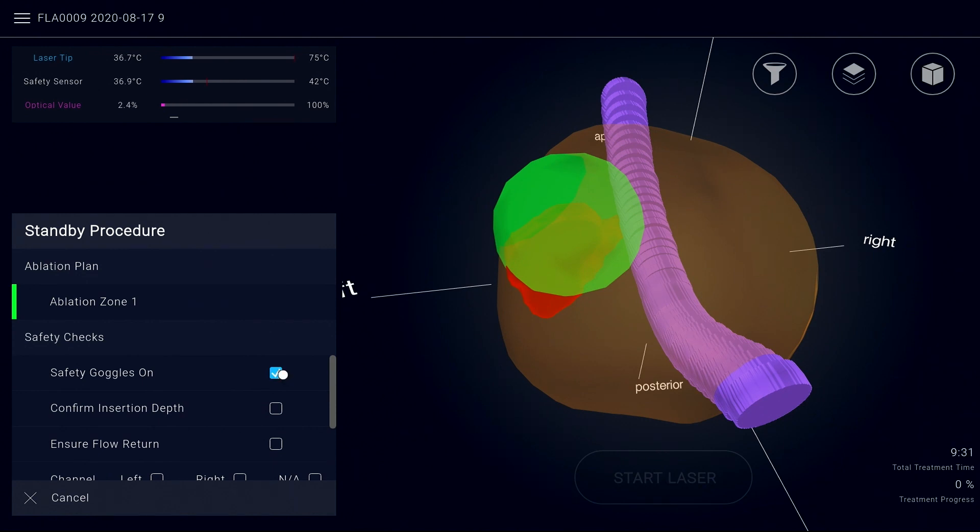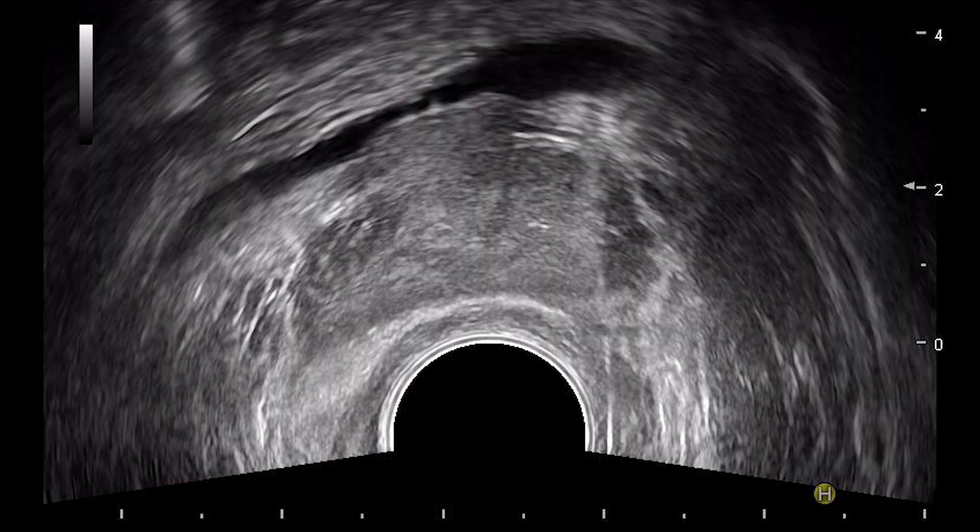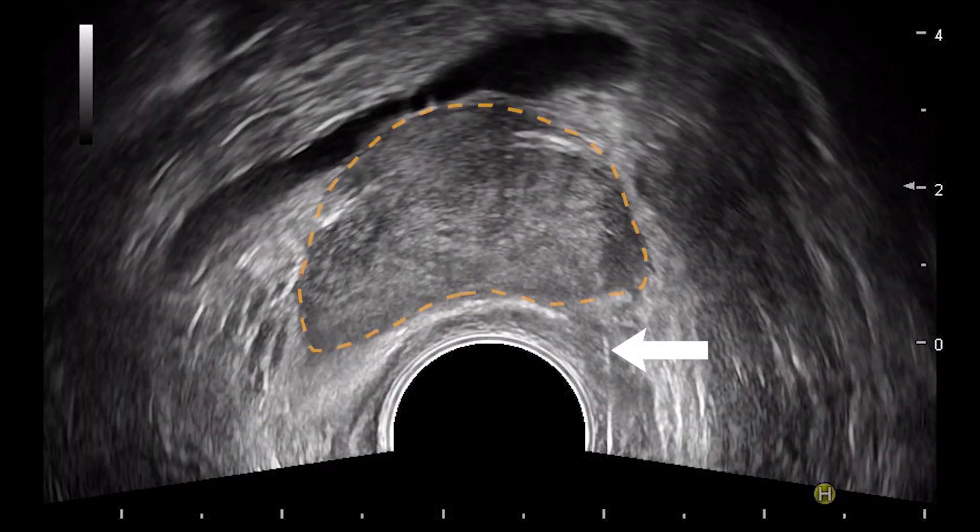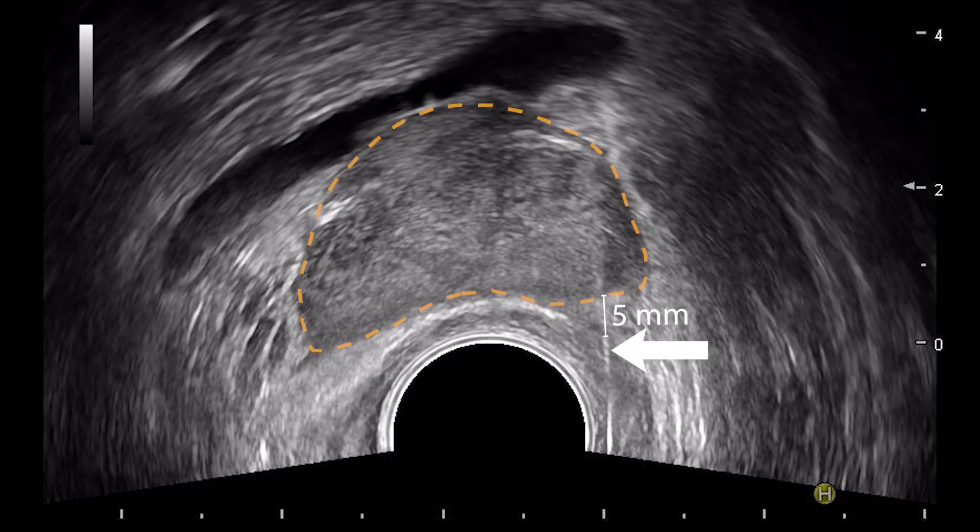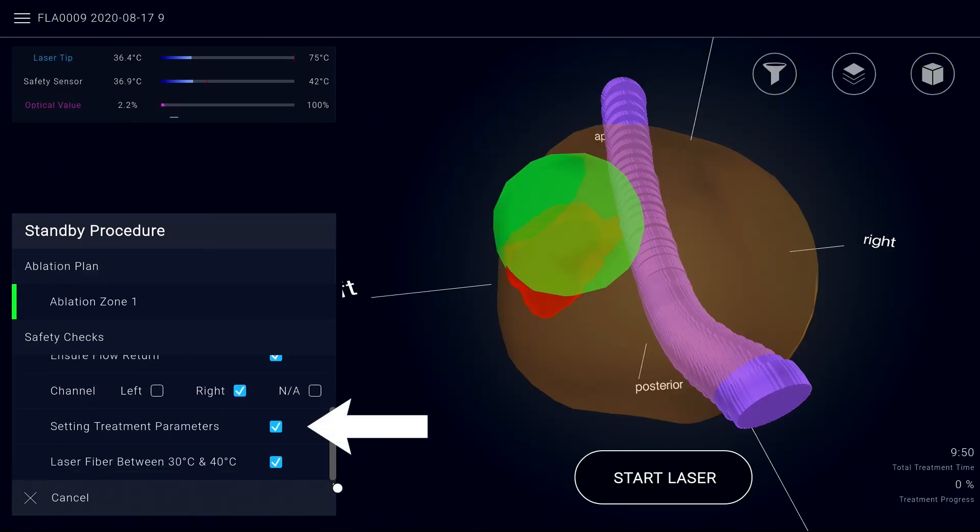Perform the safety checklist displayed on the left side of the screen. Laser safety goggles are donned, including the patient. The appropriate positioning of the echogenic bands relative to the prostate capsule is confirmed. Finally, the Orion system will automatically load treatment parameters and check that each thermocouple within the temperature probe is uniformly reading body temperature.